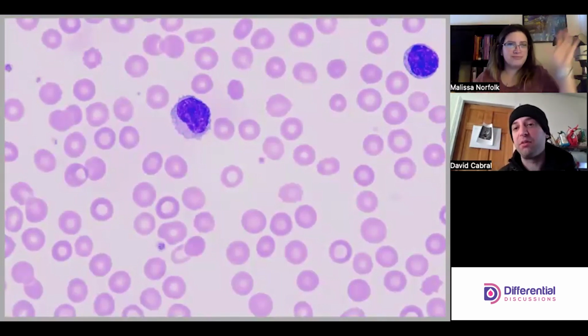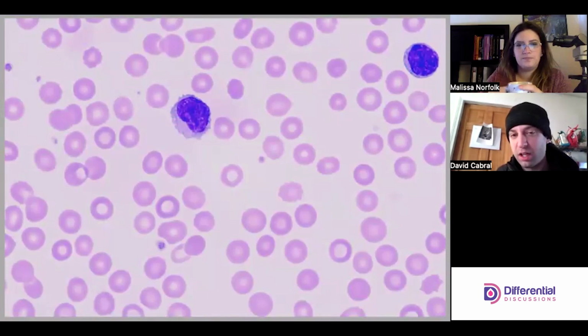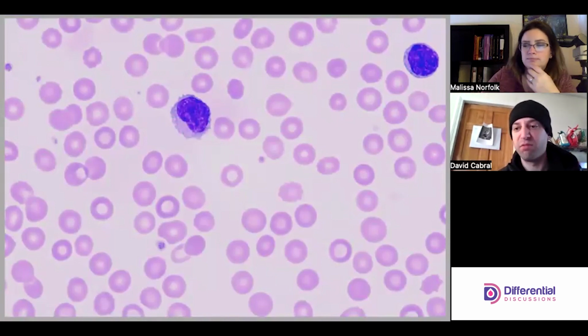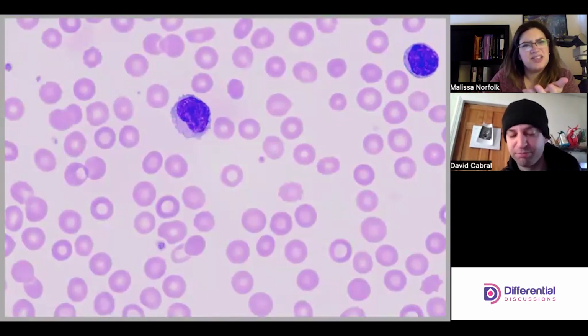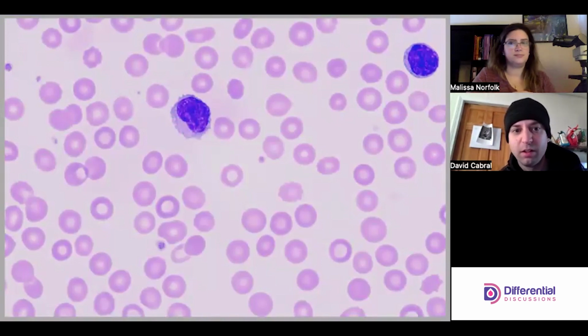But yeah, we see characteristic lymphocytes, right? These are kind of, I hesitate to use normal resting given the pathology, but resting lymphs. Which is typical. You don't usually see the reactive forms. I mean, occasionally, but for the most part in CLL, they look like normal resting lymphs. So both of those are lymphs.